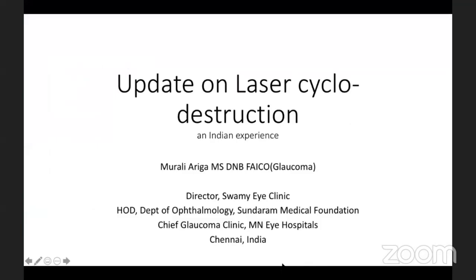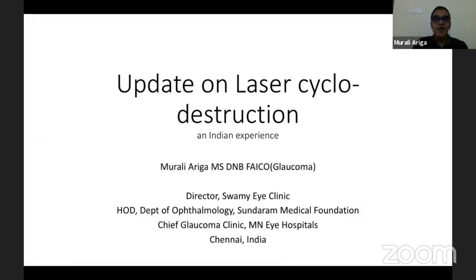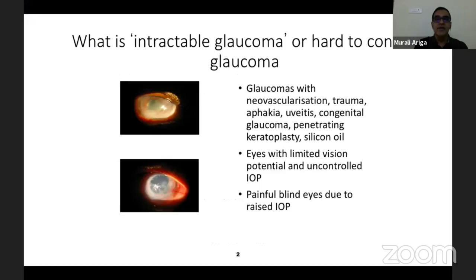Yeah, thank you. I'm going to speak on an update on a recent technique which we have been doing in our practices, and this is on laser cyclophotocoagulation using the micropulse laser. Intractable glaucomas in the past have been difficult to handle: glaucoma and aphakia, trauma, neovascularization, post-penetrating keratoplasty, and eyes with poor vision and painful blindness. All of these procedures we were doing in these intractable, hard-to-treat glaucomas.